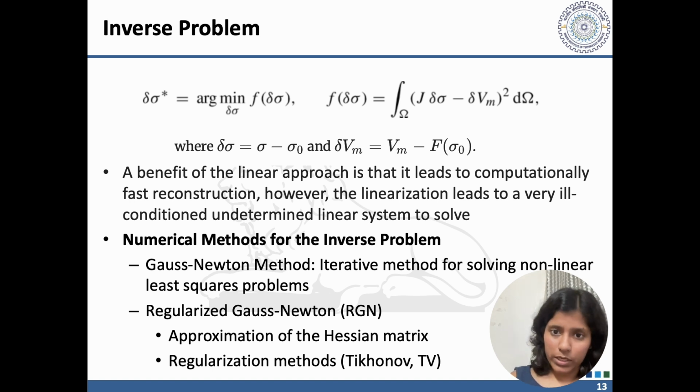There are numerical methods for the inverse problem. We can use the Gauss-Newton method, but specifically we use the regularized Gauss-Newton method, which approximates the Hessian matrix and applies the regularization methods for better results.